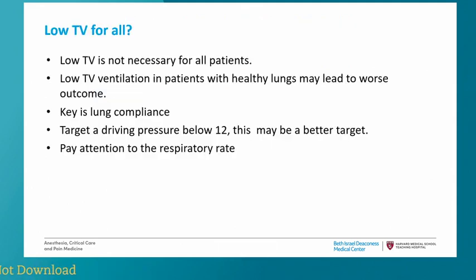So low tidal volume for all, I would say no, it's not necessary in all patients. Low tidal volume in patients with healthy, compliant lungs may lead to a worse outcome. So the key is to look at the lung compliance.